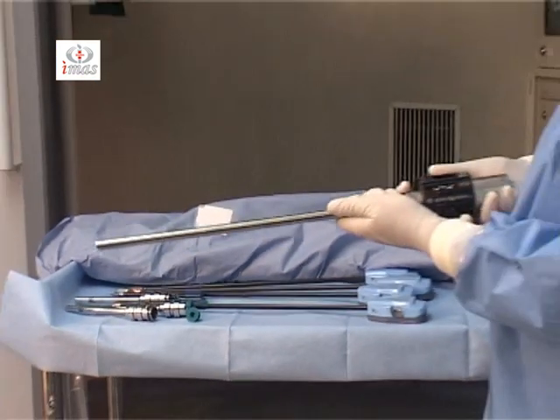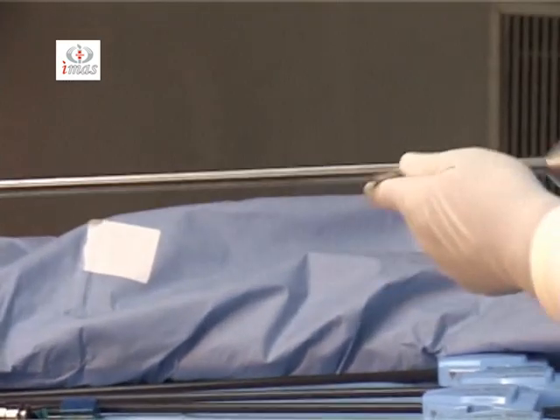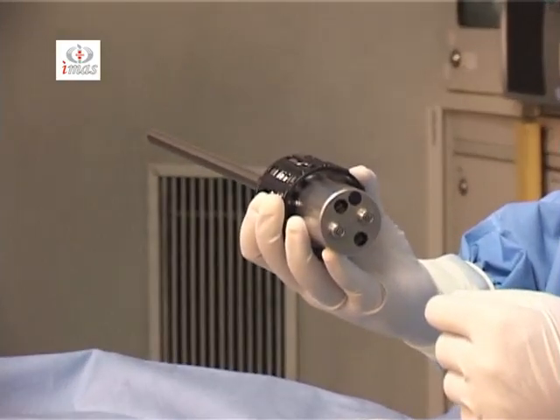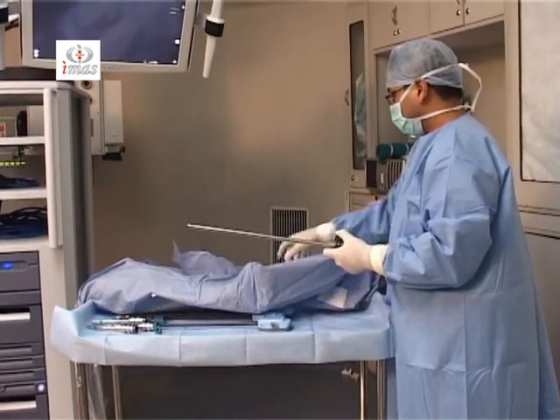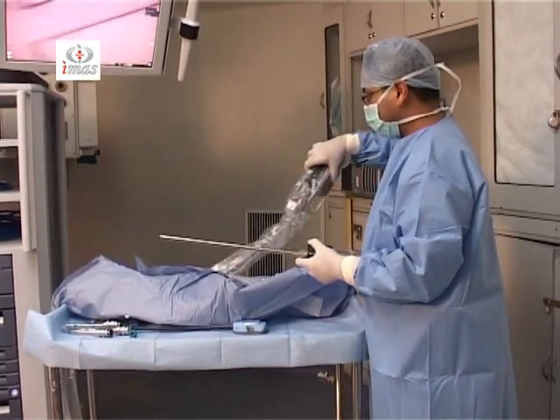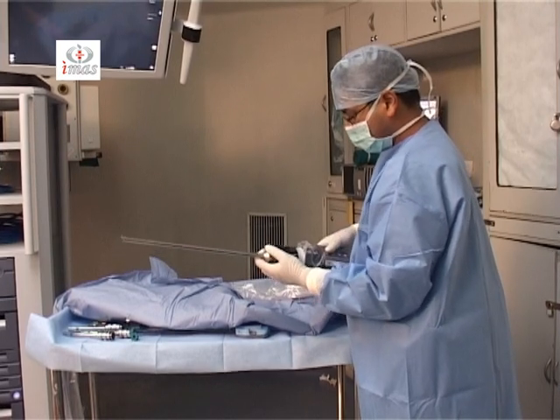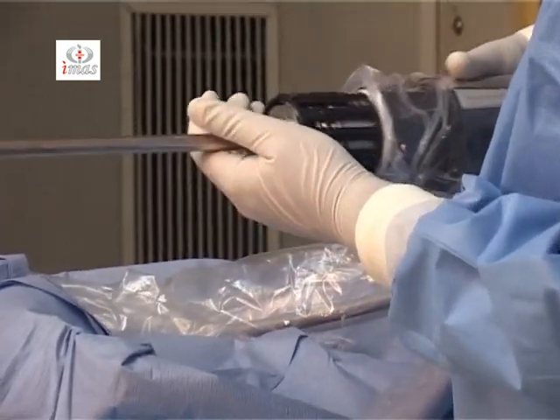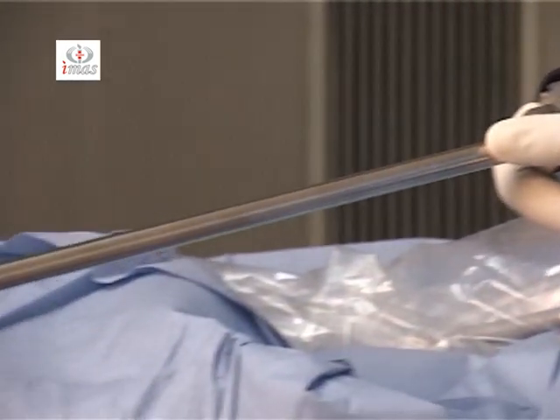This is the 30 degree scope which is used for having a 3-dimensional vision, because it is having two scopes within one scope. So now I'll place the 30 degree scope onto the camera head and lock it. So this is a 30 degree down position, and this is being displayed on the LCD screen as well.